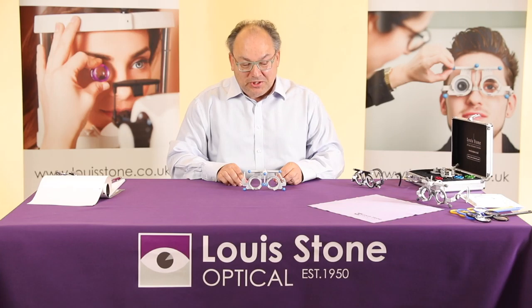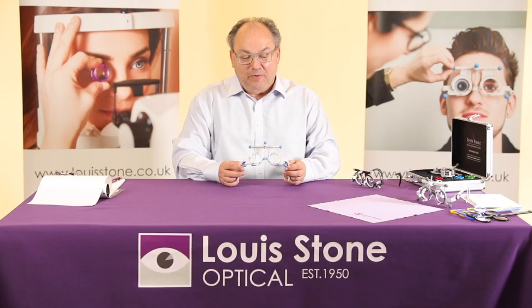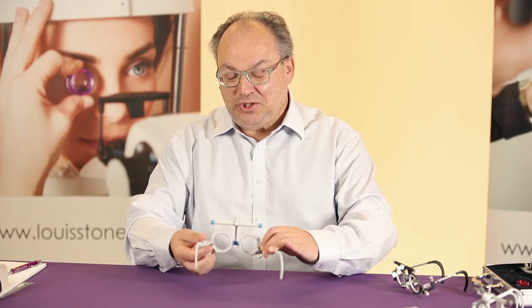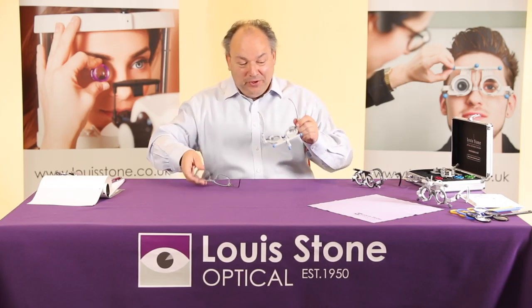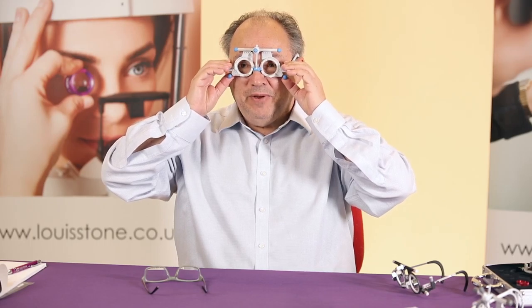We do have two others which I'll show you shortly. The main selling point of the UB4 is it takes three trial set lenses at the front and it also takes two trial set lenses at the back. Very popular.